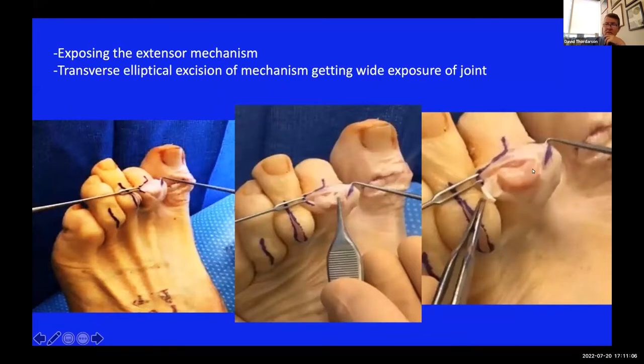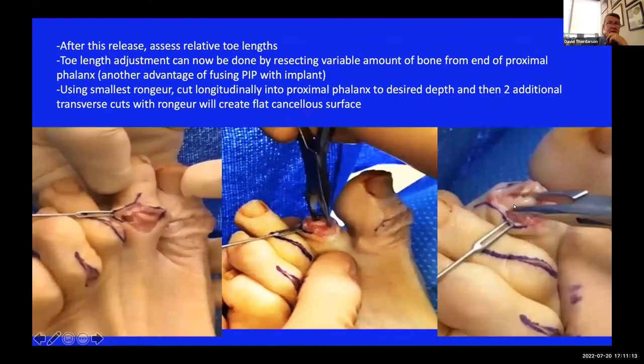Once you've taken that out, you're looking right at the condyles on the joint. You can take a knife and release your collateral ligaments so you have the proximal phalanx sticking out of the wound. Now you want to look at the length of your second toe versus your big toe, because you can adjust toe lengths through your fusion site. If you have a really long second toe - which is not unusual - I might take five or six millimeters of bone off the proximal phalanx to intentionally shorten it. I use a small rongeur and bite end-on, set the depth of resection, then turn the rongeur sideways and make two more cuts - three passes gives you a flat cancellous surface perpendicular to the long axis of the toe.